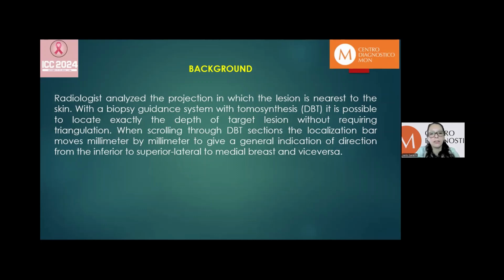Radiologists analyze the projection in which the lesion is nearest to the skin. With a biopsy guidance system with tomosynthesis, it is possible to locate exactly the depth of the target lesion without requiring triangulation.